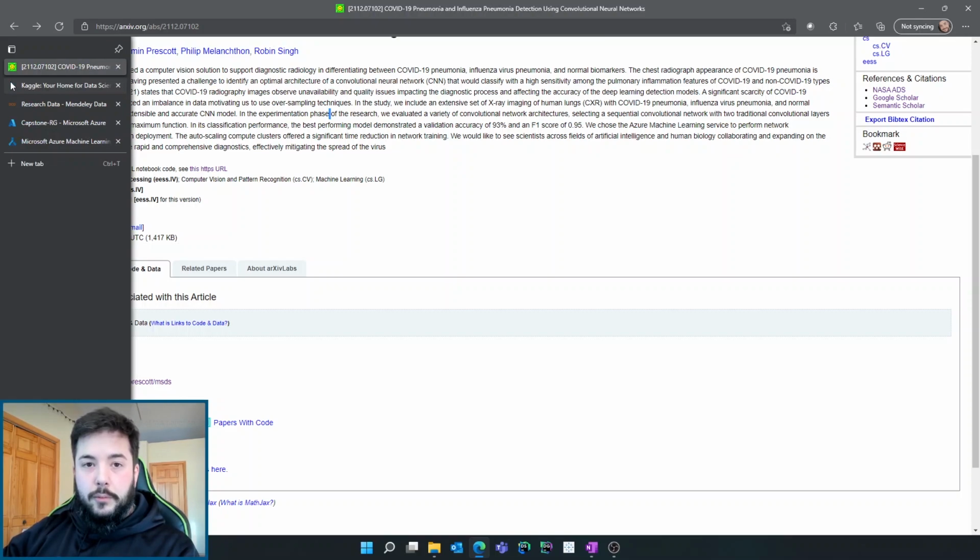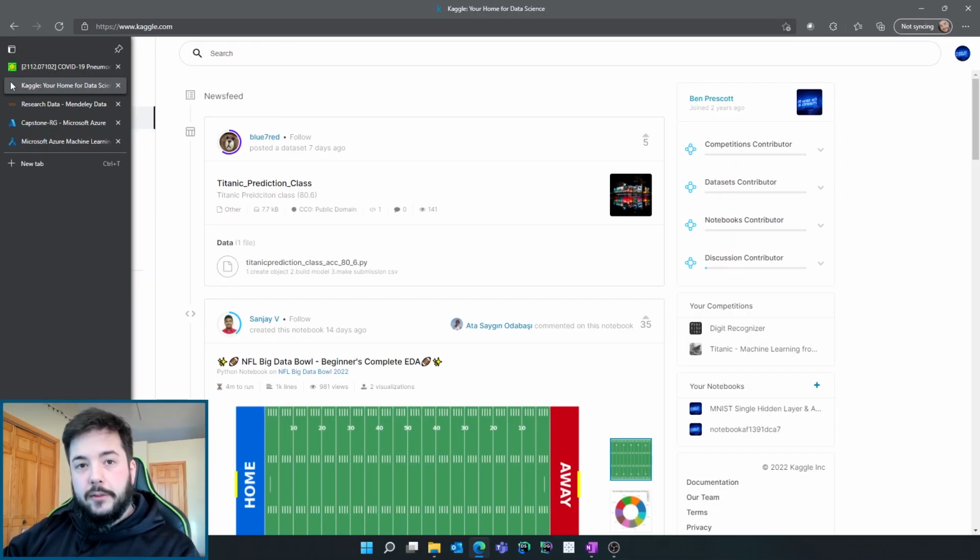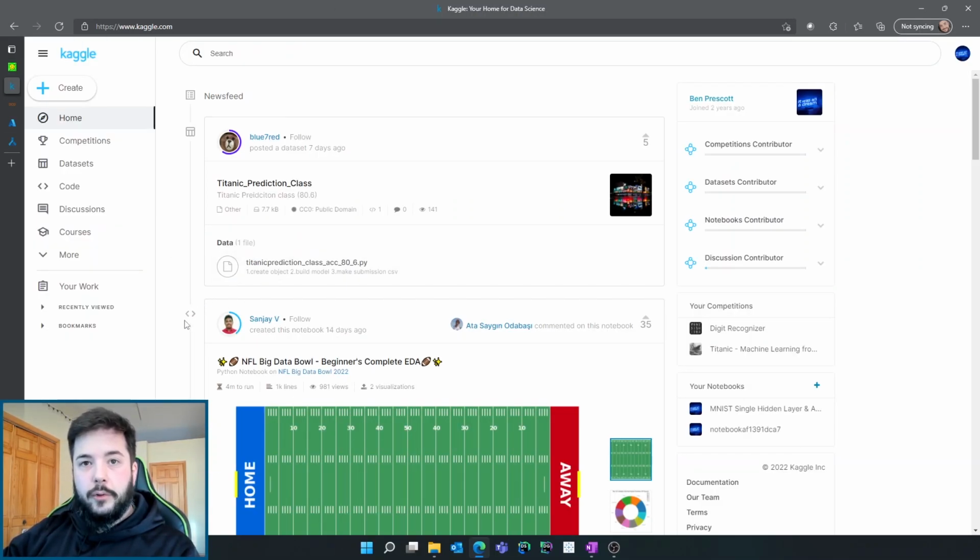A lot of the data, actually all of the data that we use in the project, is publicly accessible. Everything is sourced from two main repositories. One is Kaggle. For those of you that are not familiar with Kaggle, you can treat it as an online data science and machine learning community, if you will, that has things like datasets and discussion boards. People will share their Jupyter notebooks. You can actually run your own notebooks through what's called Kaggle kernels, which is like a hosted compute instance. You can get some of that for free. You can also have a paid tier. It's a great place to go for overall learning and for accessing a lot of different types of data to play with and learn different machine learning approaches.